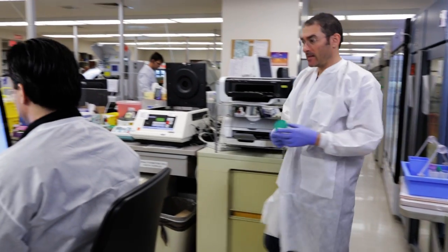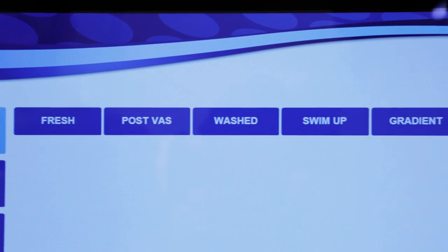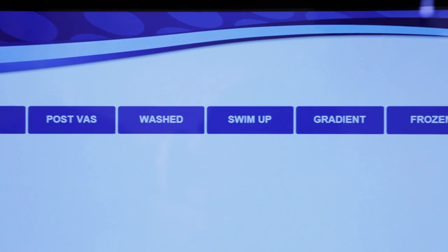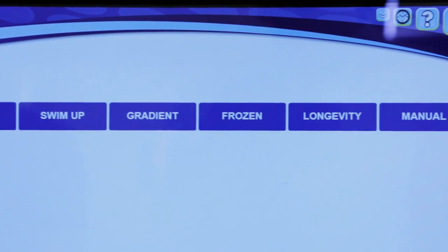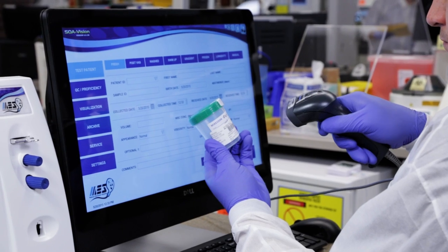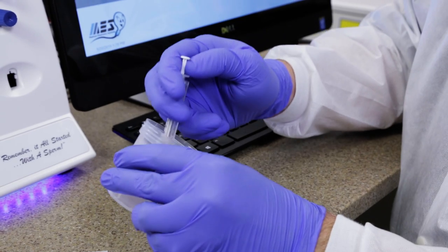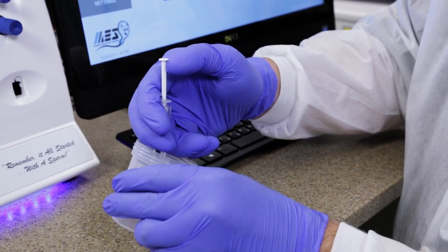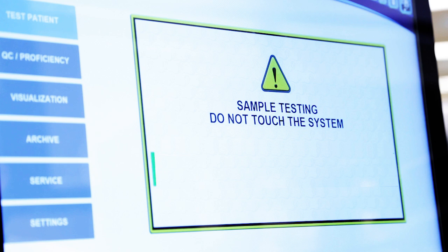Now it's time to test a patient. The SQA Vision can run eight different sample types to meet the testing requirements of any facility performing semen analysis or doing any kind of sperm preparation. To run a sample, input some basic patient information and mix thoroughly. Load the disposable testing capillary and insert it into the instrument. The test starts automatically.